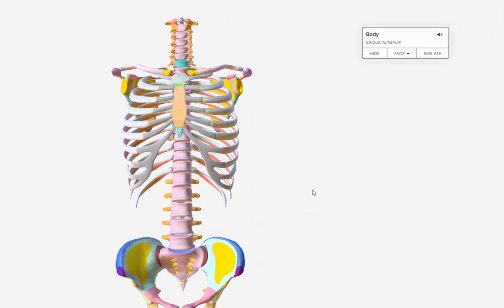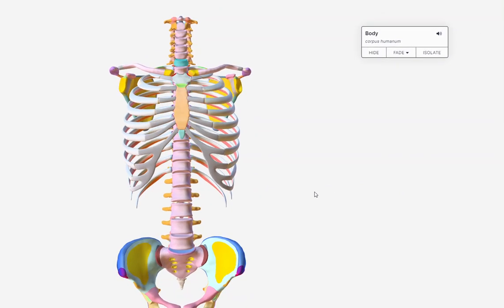Now they're laying flat on their back, or they're standing with their back flat against our upright bucky, or if you're imagining them laying on the table, whatever's working for you. Because we're going to do these positions either upright or laying down on the table, you have to imagine it both ways when we're looking at it. So now we're facing our patient. Our patient's facing us. We're here, working the collimator box and the tube and putting our center ray on our patient. So now the center ray is going to enter the patient anteriorly and exit them posteriorly.